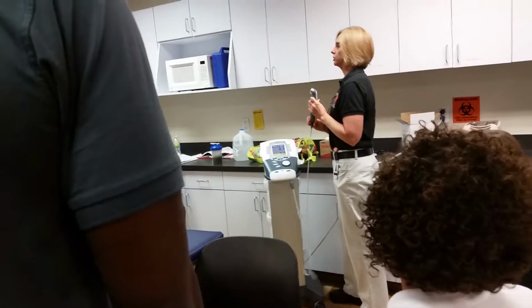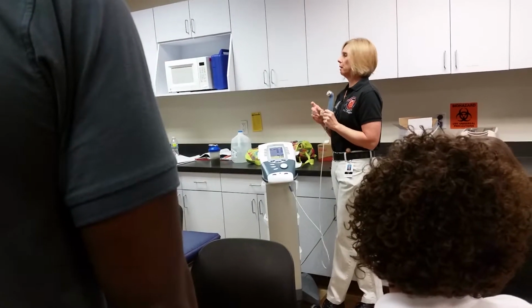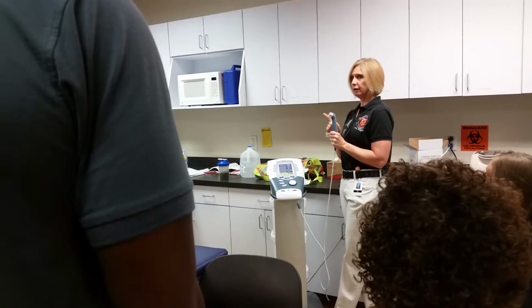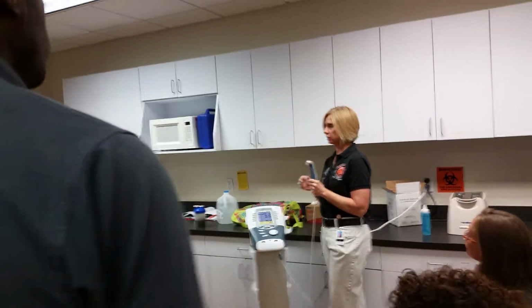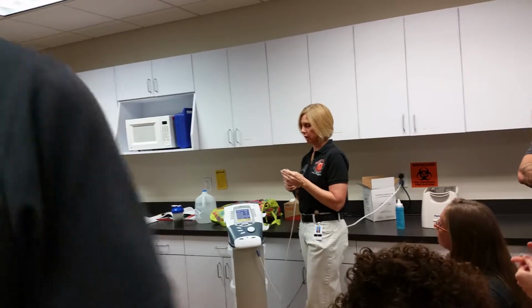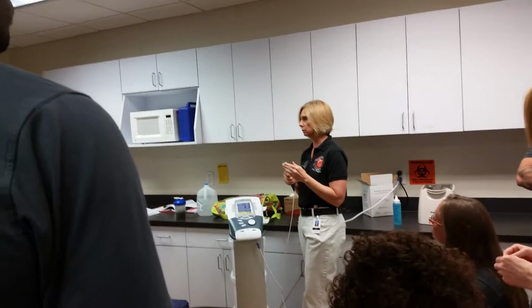So this is considered a 5 centimeter squared sound head. Remember that the actual ERA is a little smaller, so you're treating 5 to 10 minutes for 2 times this. See how small the area is that you should be using. I don't know if some of you have volunteered in clinics and see people doing like an entire lower back. They're not doing an effective treatment. It's part of the reason why the research doesn't necessarily show improvements, because it's not being applied correctly.